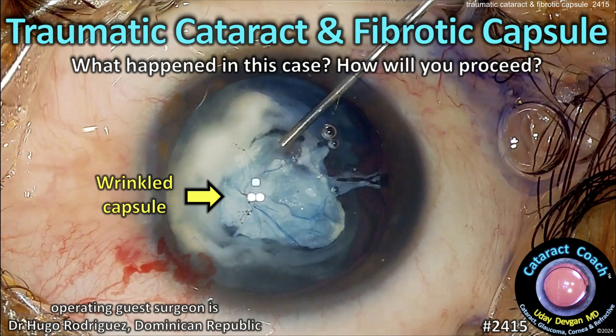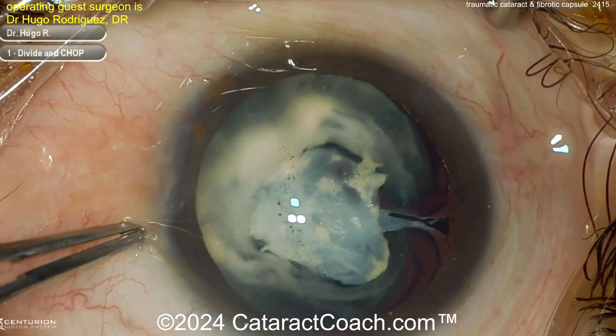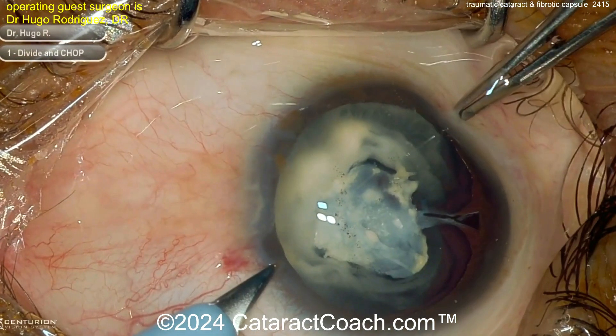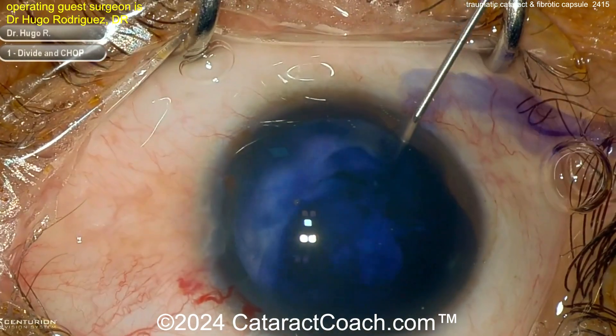From cataractcoach.com: traumatic cataract in a fibrotic capsule. This is a tough case — look carefully, you can see there's a very wrinkled and fibrotic lens capsule. You can see a lot of white cataract lens material, but something looks a little off here.